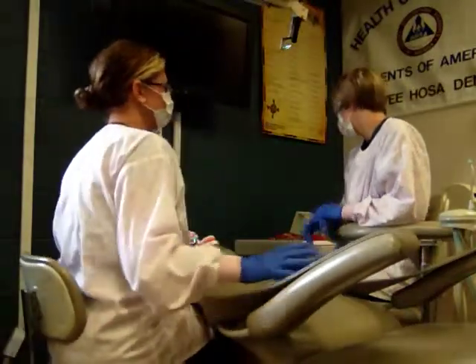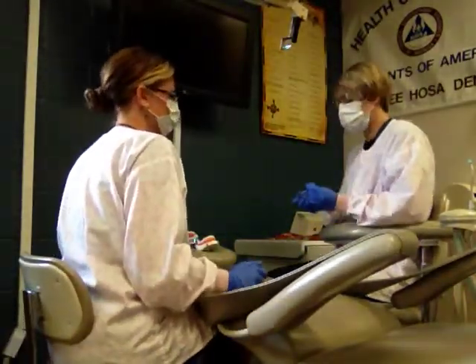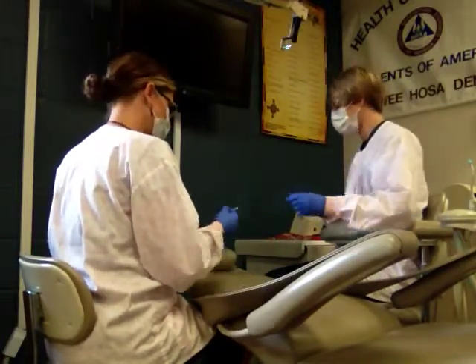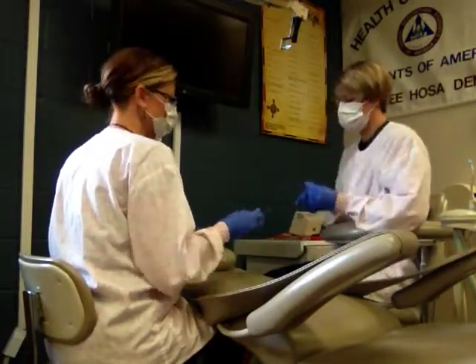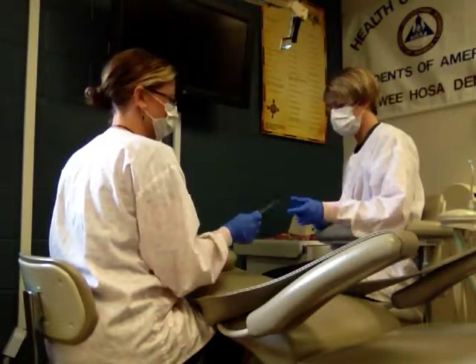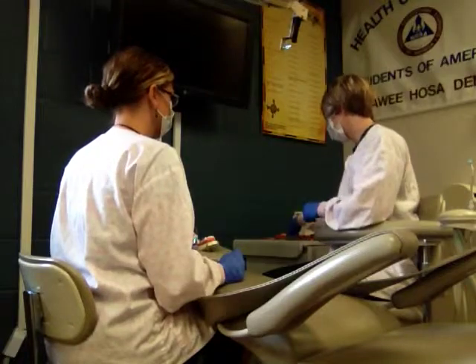Now we're going to do composite number three for skills, and that's when we're going to use a mylar strip. We're going to work on number 24, so we need mirror and explorer. You'd use a mylar strip if you were using a mesial or distal filling — anything in a proximal.